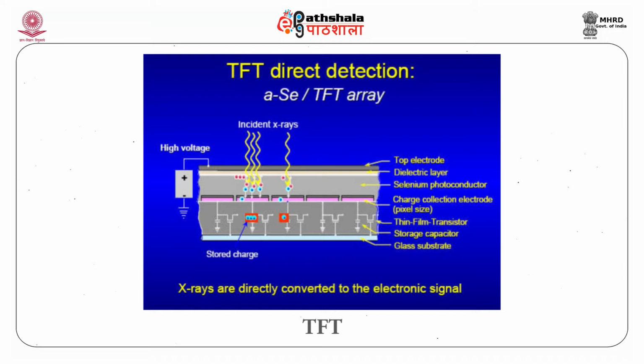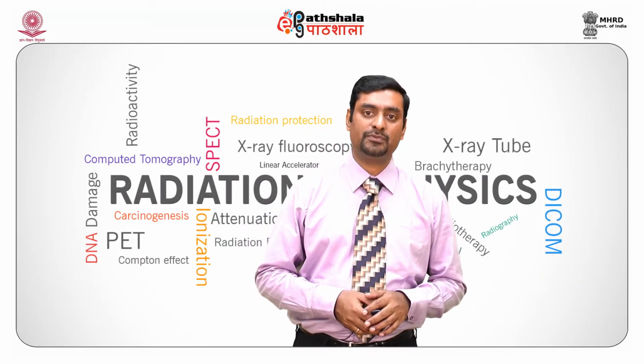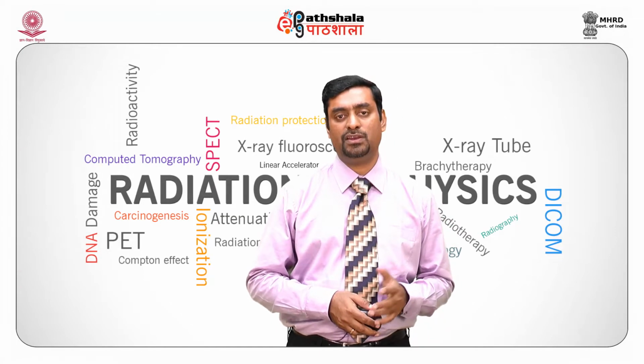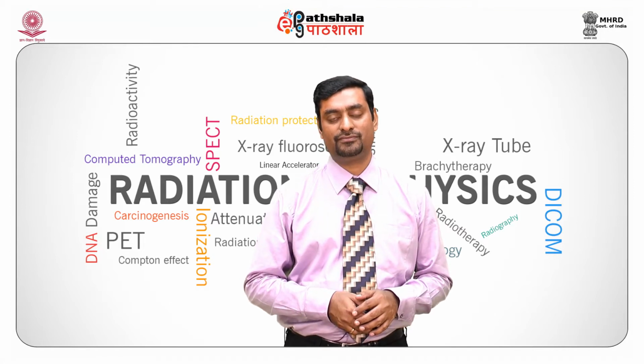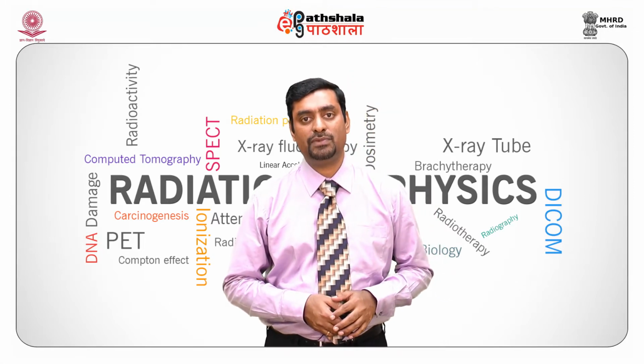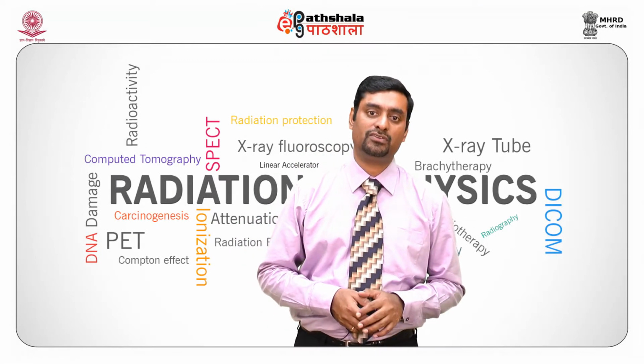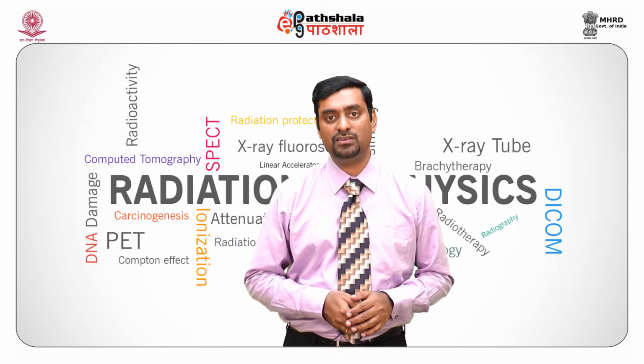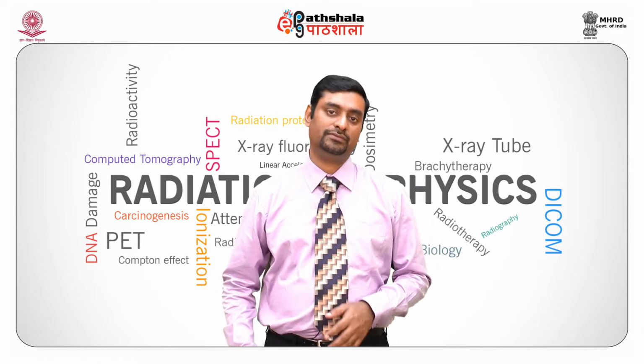What is the advantage of a direct flat panel detector? It has high spatial resolution, comparable to imaging detectors, very close to a film screen combination, and has a field of view of approximately 25 by 29 centimeters. Pixel size can be as small as 70 microns. Obviously, we need to see microcalcification, which is about 100 microns. Hence, this fits in with a 70 micron pixel. It is possible to get a good image quality.